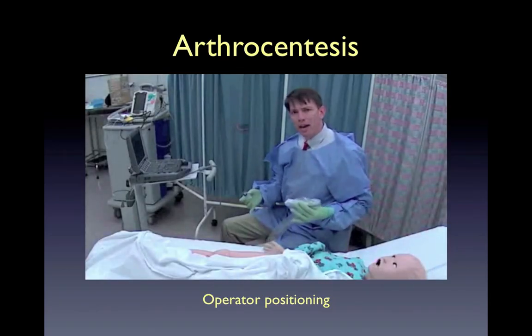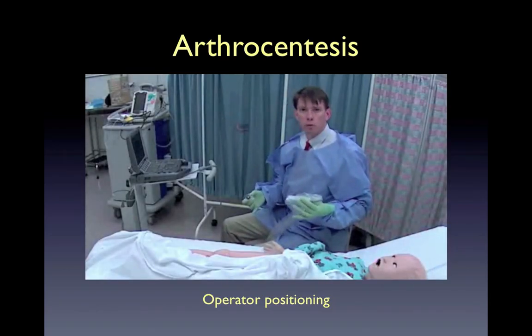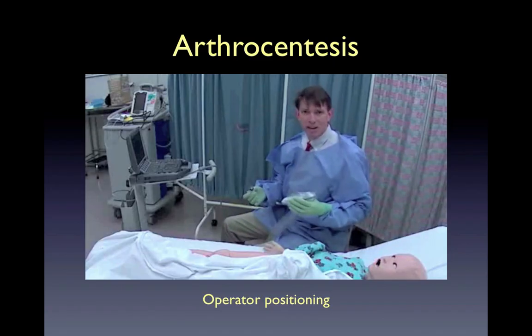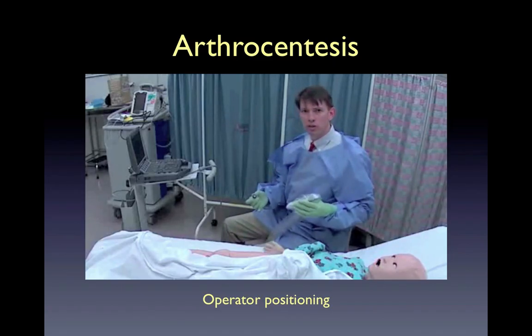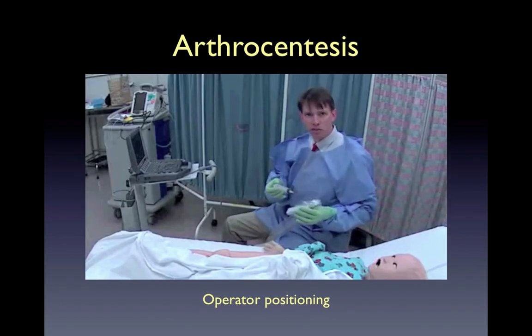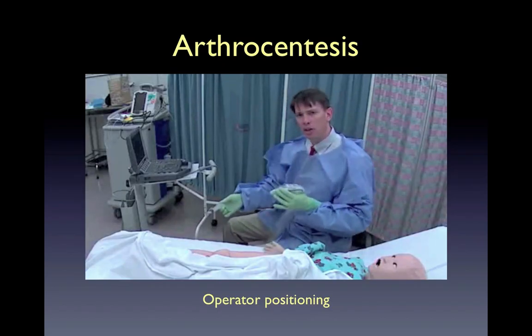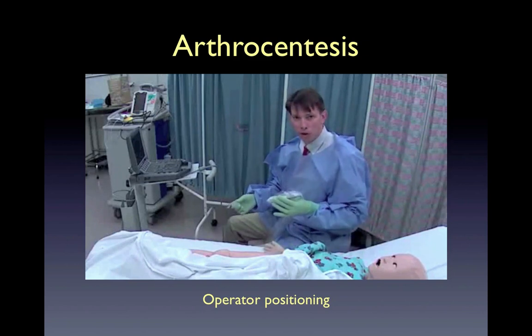Naturally, ultrasound-guided hip arthrocentesis is performed using strict sterile conditions. For a right-handed operator performing this procedure on the right hip, I recommend positioning oneself adjacent to the patient's right shoulder with the ultrasound machine adjacent to the patient's right foot.